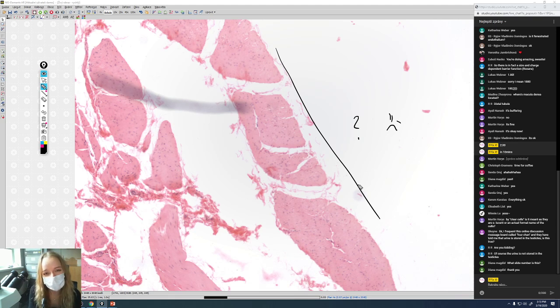So the muscularis of the bladder is too thick for our light microscopy. So there's just an artificial cut, and we are not able to see serosa on its surface. So it's going to end with the muscularis, and yeah, we don't really have much more to see right now. So sad. We cannot see serosa here, only the 2 layers of muscularis.